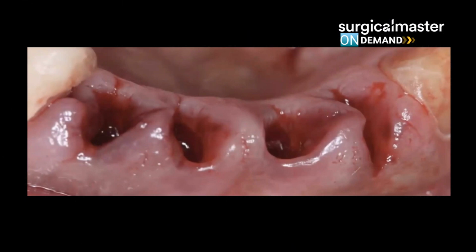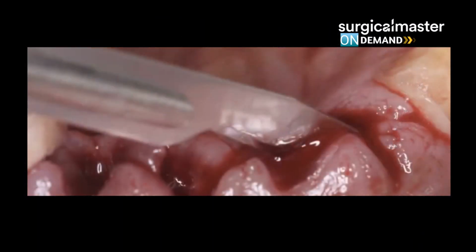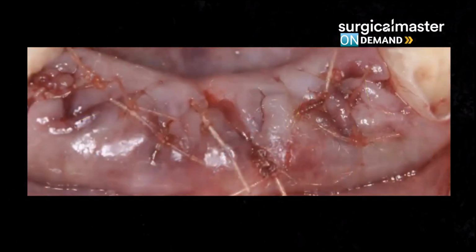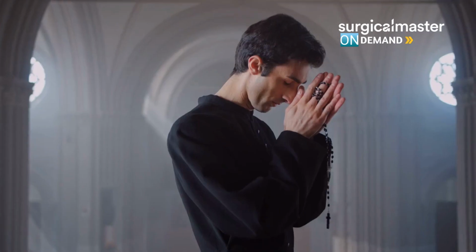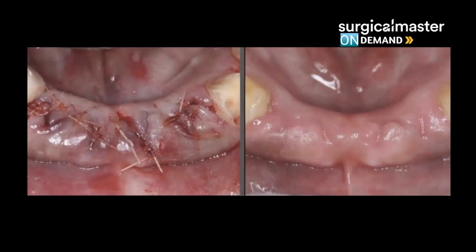So just to repeat this technique in another case, here is again lower incisors extracted because of a periodontal condition. We have the flabby ridge. We create a couple of diagonal incisions, splitting the papilla, releasing them, doing the grafting with your bone graft of choice, with a collagen plug, finding where those papillae are going to fit, and fit like a prayer, connect them with simple interrupted sutures. You're getting literally a primary closure. You're getting the attached tissue. We're not compromising the attached tissue by doing so. We pray a little bit. Why not? And then you get just a beautiful ridge within 2-3 weeks.